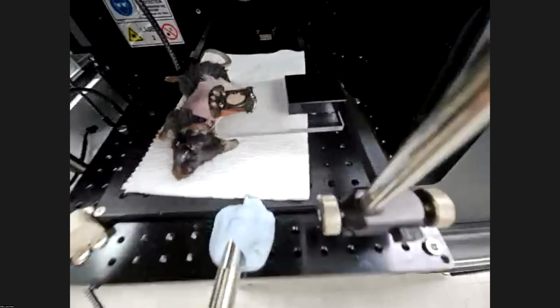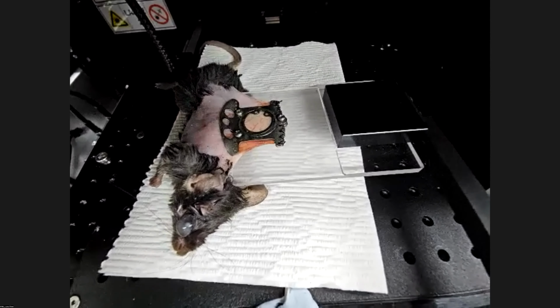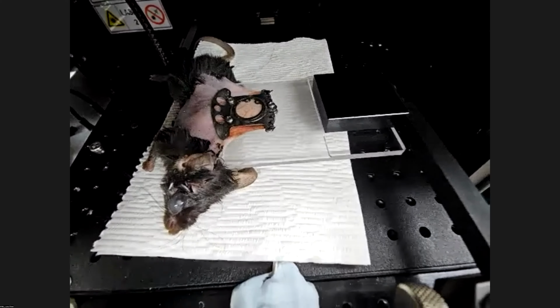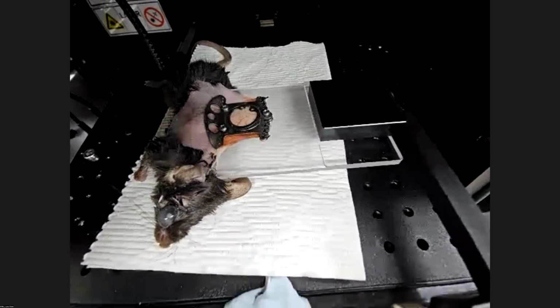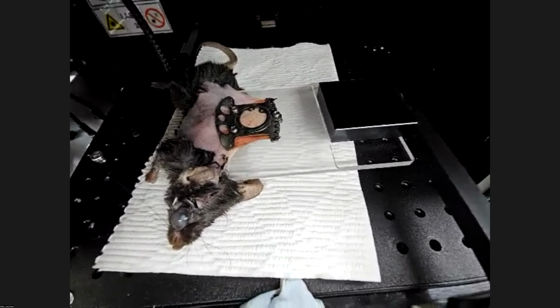So when it comes to the surgery procedure, the implantation of the dorsal skinfold chamber onto the mice, I will briefly explain it. After we've gently folded the dorsal skin, one side of the back skin was removed in a circular way and replaced with a 12mm cover slip.